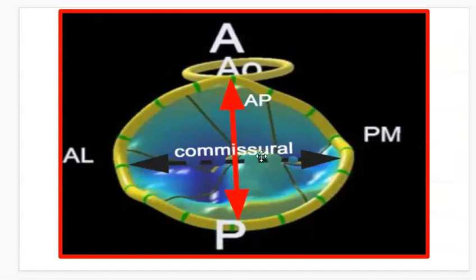And this is just a picture of Philips program. This is obviously not a moving 3D picture, but Philips actually has, like I said, a mitral valve program in there where you can get deeply involved in the mitral valve and the leaflet structures and whatnot, and exactly where they're going to clip it or repair it or whatever they're going to do to the mitral valve. So that's a whole program you can learn outside of just anything else on the TomTec software, and I'm sure GE and such and Toshiba have their own software for that too.